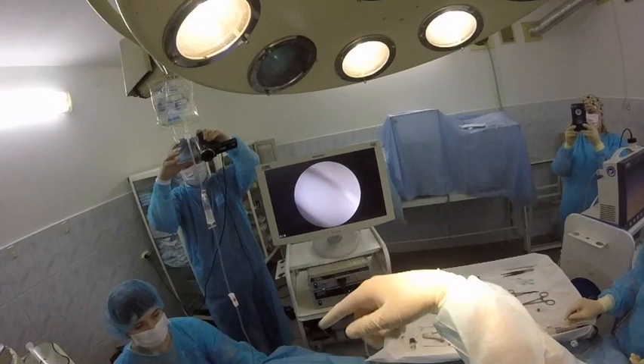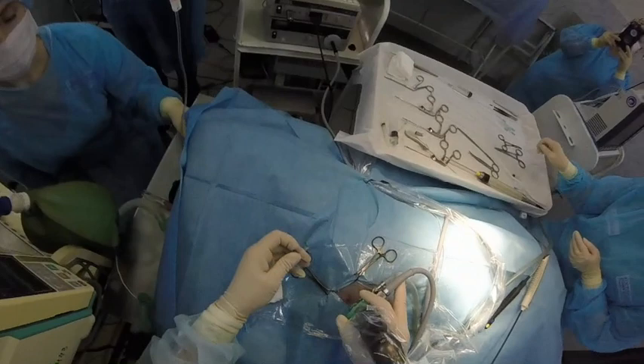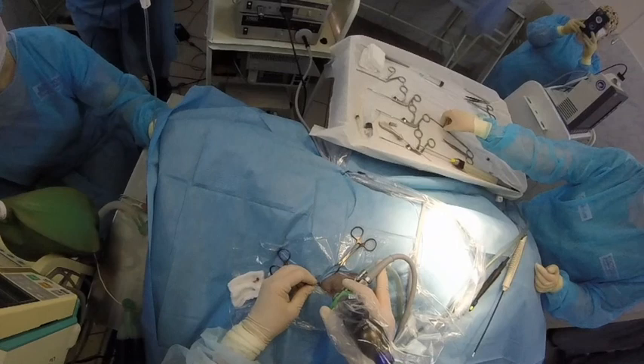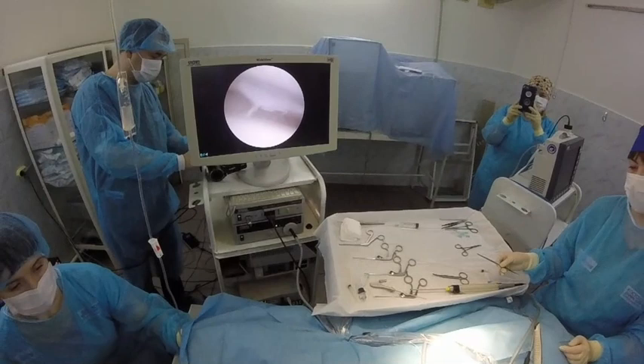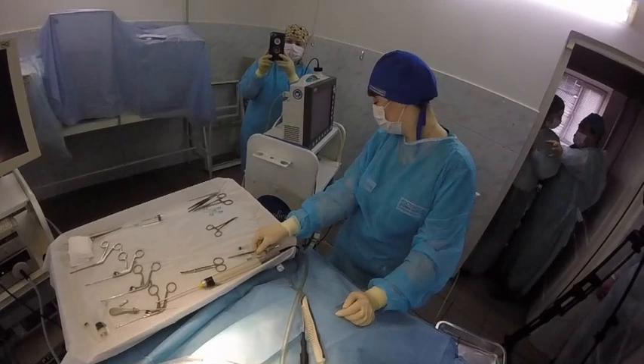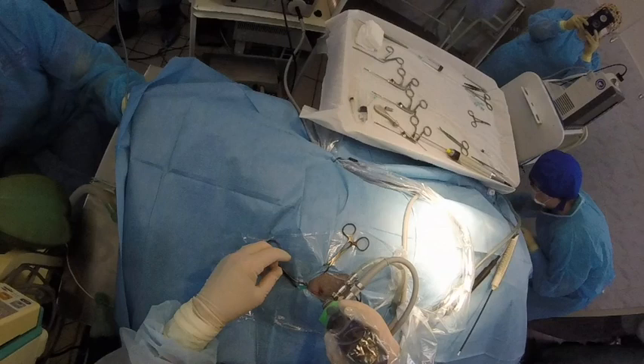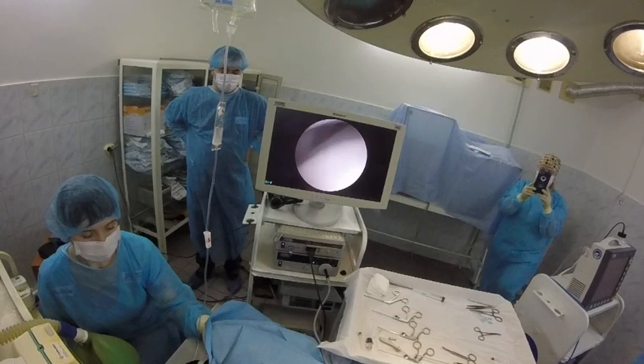You can change the view — give me the inside view please. Give me the needle please. Insert the irrigation needle. As you see, we are in the joint. Give me more power. We find tendon musculus biceps brachii and the coracoacromial structure. We are in the joint.